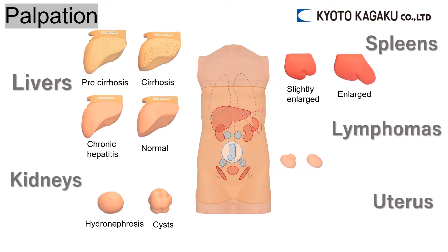Two inguinal lymph nodes, normal and lymphoma. Uterine fibroid and normal uterine — the normal uterine is already attached to the model.